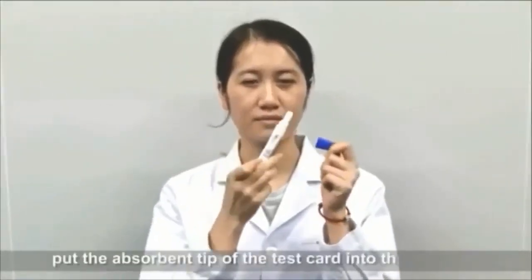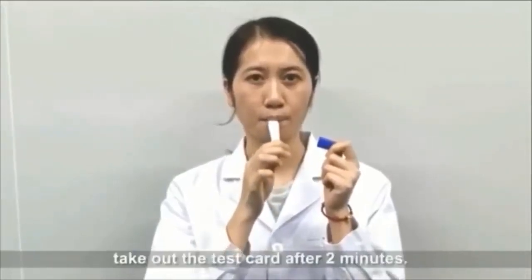Put the absorbent tip of the test card into the mouth. Take out the test card after 2 minutes.